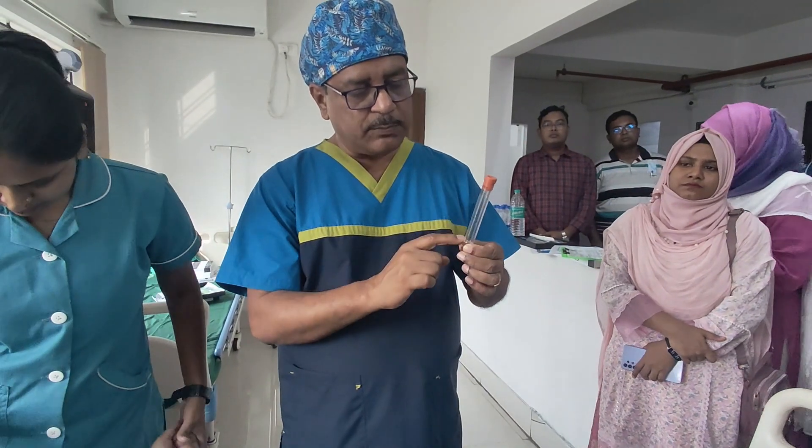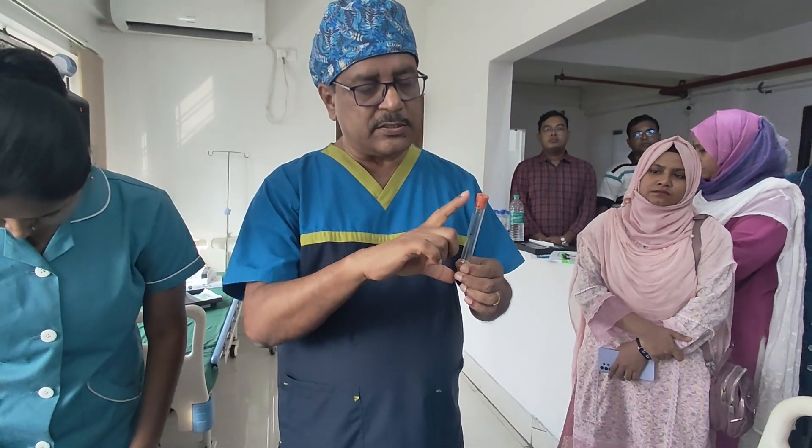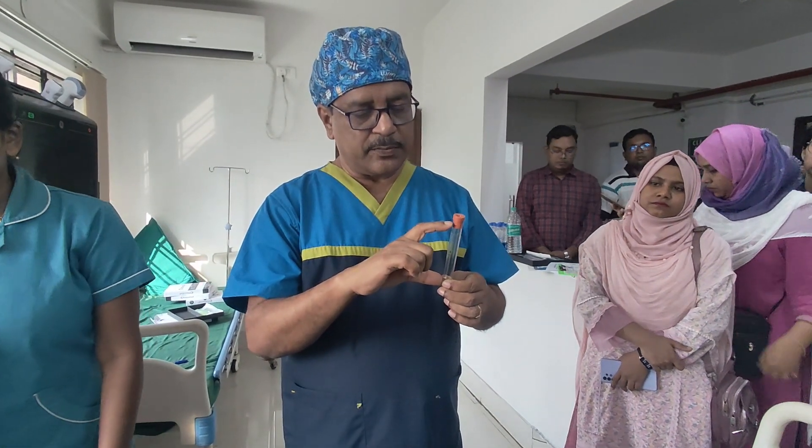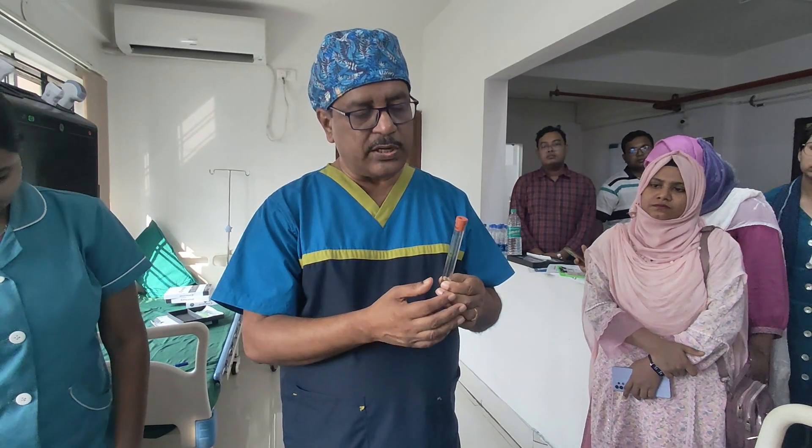We will be drawing the blood. There are several sizes of test tubes available. This one can accommodate 11 ml of blood. Some test tubes can accommodate 8 ml of blood, some can accommodate 22 ml, and different other sizes are available.